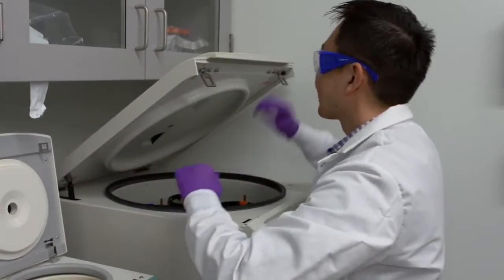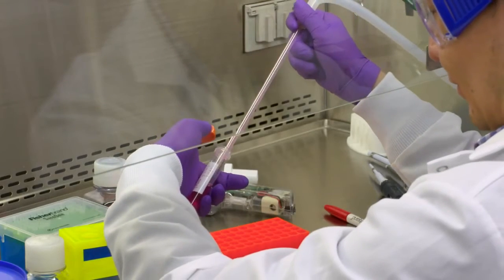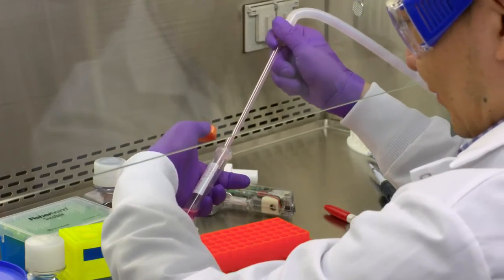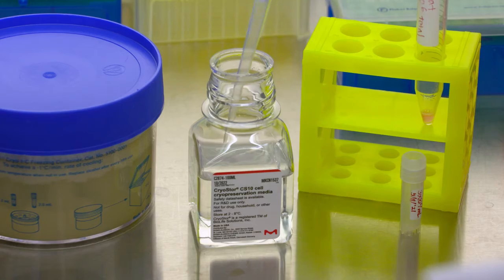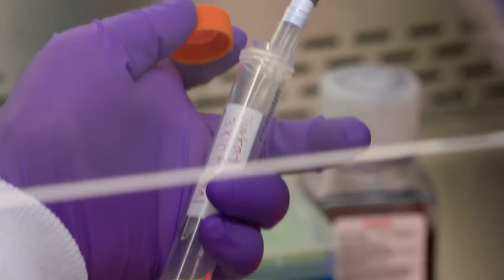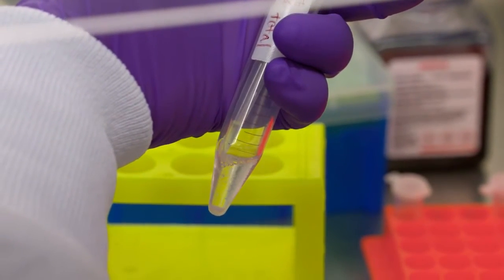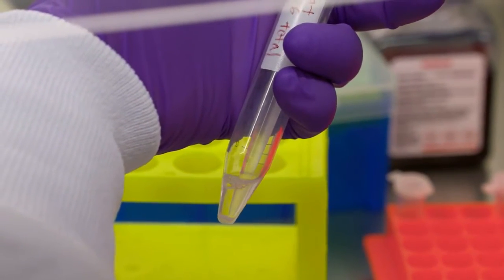Pellet cells by centrifugation. Carefully aspirate media without disturbing the pellet. Gently but thoroughly resuspend the pellet in the appropriate volume of chilled freezing media and transfer 1 milliliter aliquots to pre-labeled cryovials.